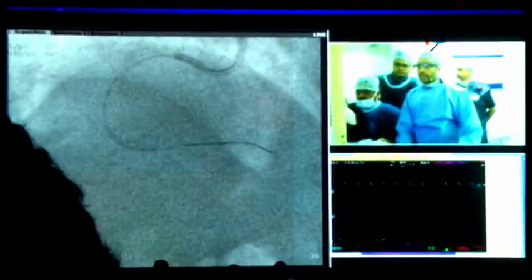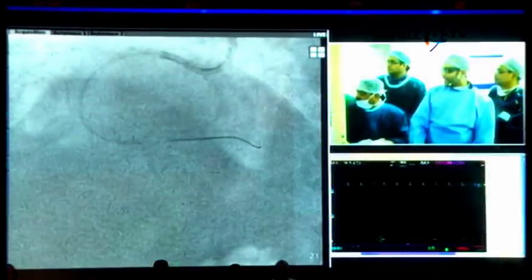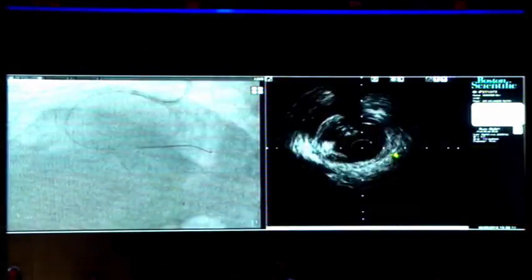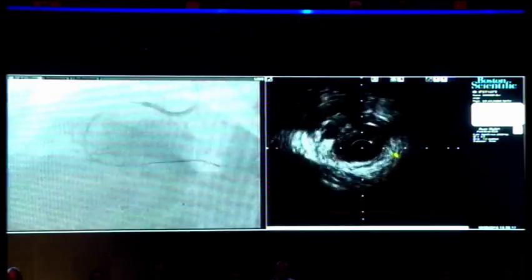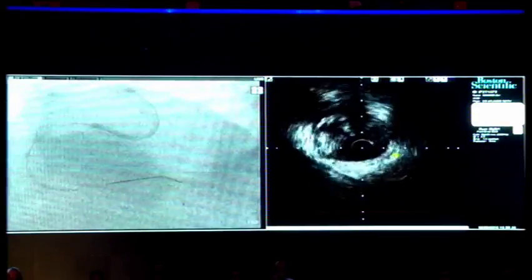So, guys, you can see the IVUS till where we are, I guess. IVUS, please show the IVUS images. Can you guys see it? No, I want to actually go forward if I can. I'm still going to try and go forward a little bit and sneak in a little bit if I can. But if not, it is what it is. Okay. You are in the false lumen, I think. Yep, looks false there. But like I said, I'm not beyond the crux. So that part I knew I was false.